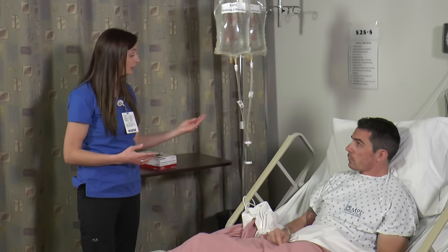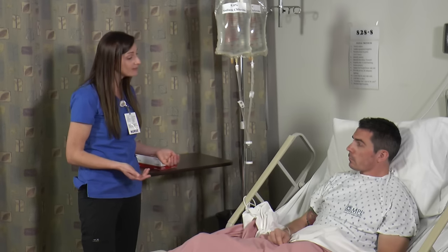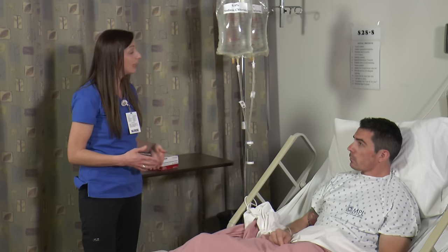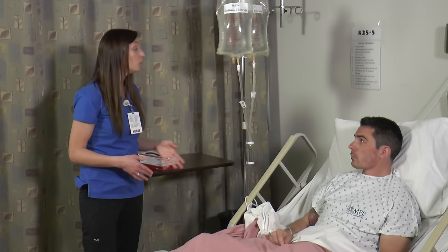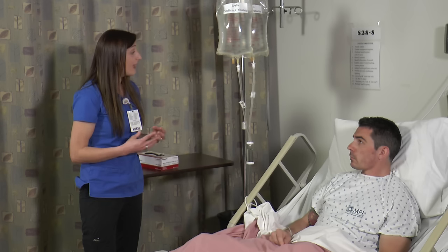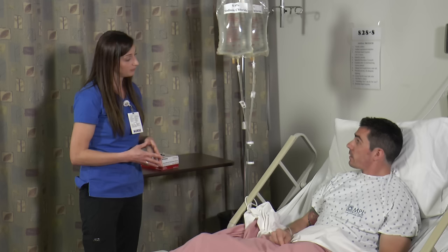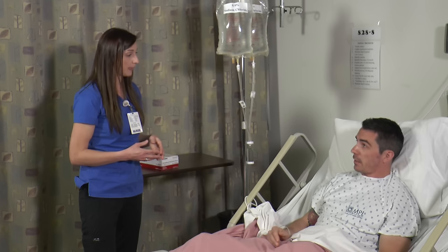Now that could be due to a kink in the equipment, so I would assess for kinks, or it could possibly be due to a clot in the bladder blocking that catheter, in which case you'd need to be manually irrigated to break up that clot, which is what they did last night. So, do you have any questions regarding the big bags and the drainage? No, that all makes sense, but it's a lot of information, and I must admit, I'm a little nervous about going home with this catheter in place.